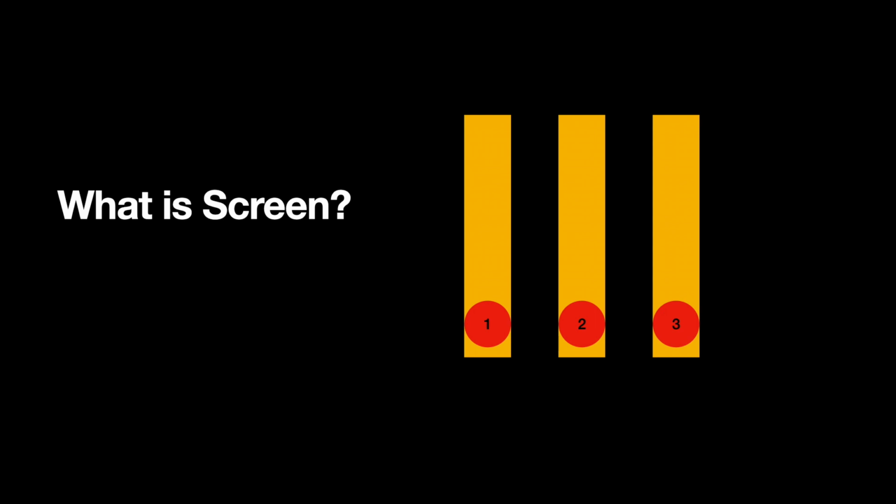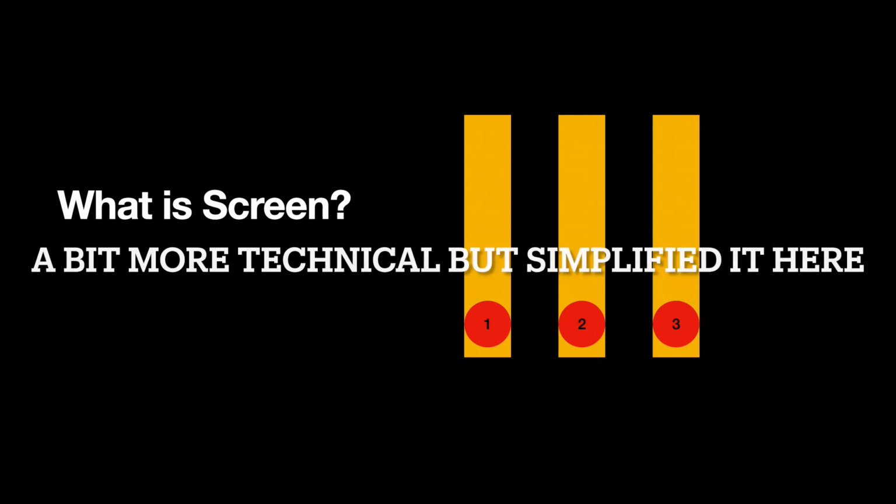At our institution, we use 3 known reagent cells, and we know what antigens they express. Then we put the patient's own plasma into the tubes. If there's no agglutination, then this is great, and it will be easy to issue blood and you're good to go.